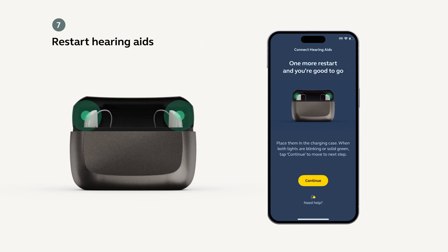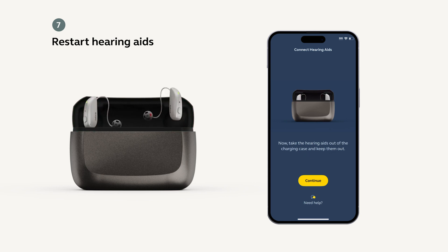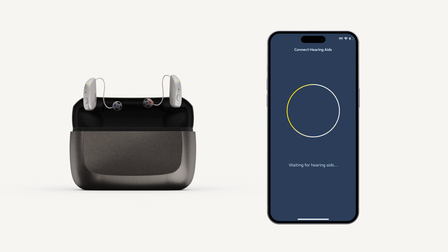After your hearing aids have been located, you will be prompted to restart them by placing them inside the charging case until the lights turn green, and then taking them out of the case. Your hearing aids will continue to connect to your device and you will eventually see you are connected.